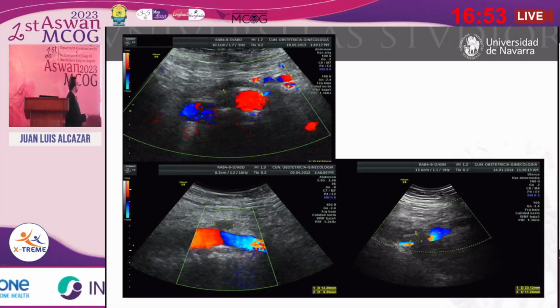And again, you can evaluate the presence of lymph nodes. This is a similar case to the previous one I showed you on the ovary. This is another intra-aortocaval lymph node. This is a lymph node in the bifurcation of the aorta, sagittal plane, promontorium here. This is the aorta. This is the common, in this case right, iliac artery.